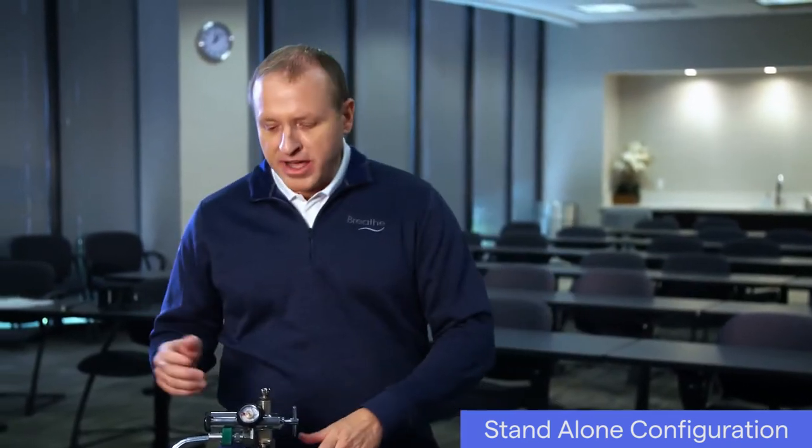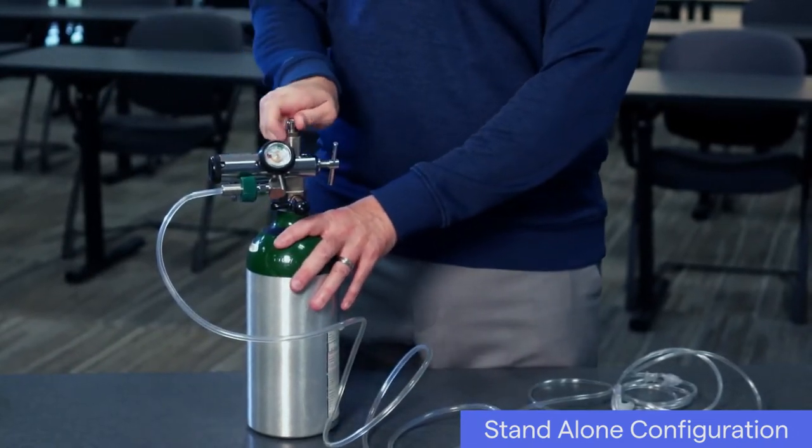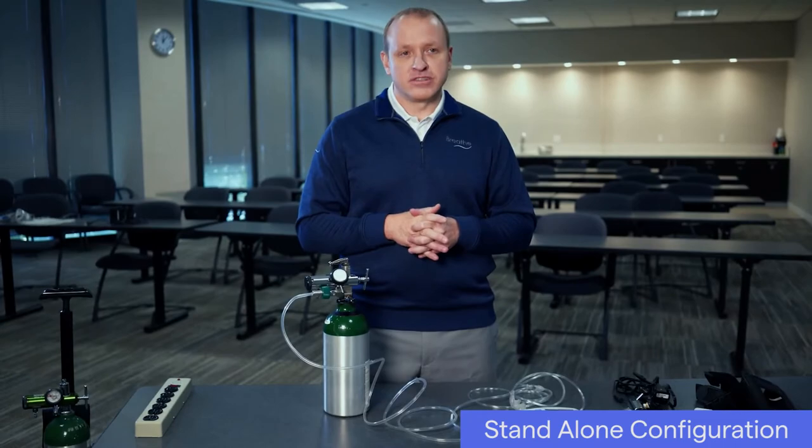Just before using the ventilator, turn on the oxygen supply according to the regulator and cylinder manufacturer's instructions. When not in use, turn off the oxygen supply according to the regulator and cylinder manufacturer's instructions as well.